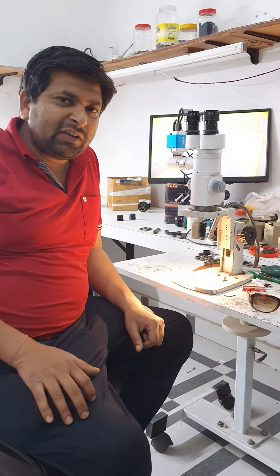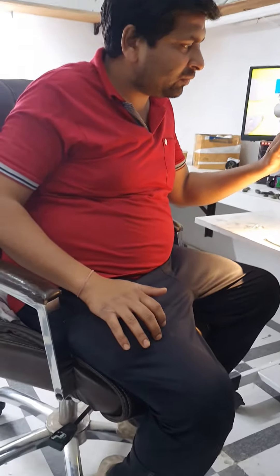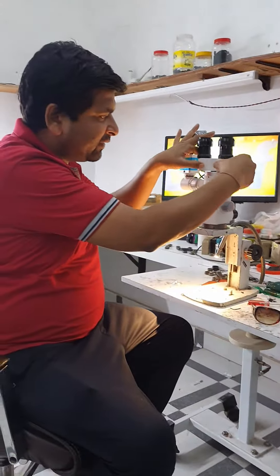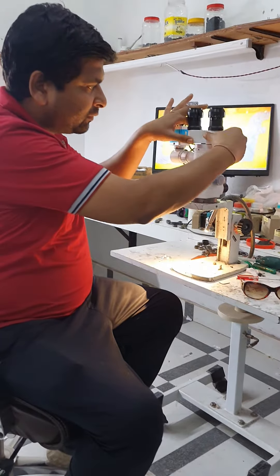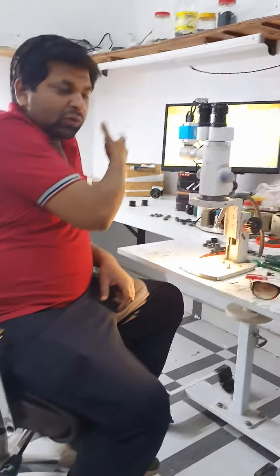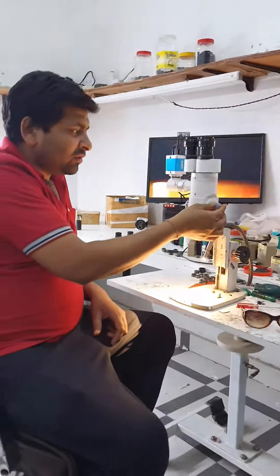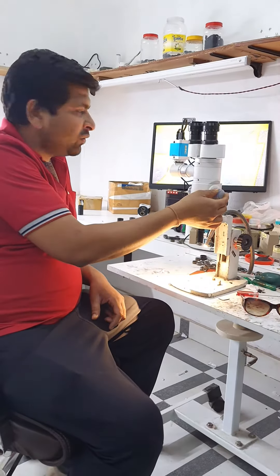You can change the magnification for more levels. You can adjust the operating like that. This is the HDMI camera. You can see the light on the screen. When we change the magnification, it will be very clear on the screen.